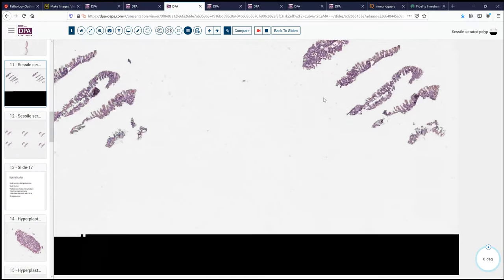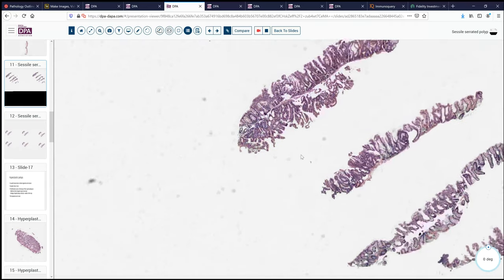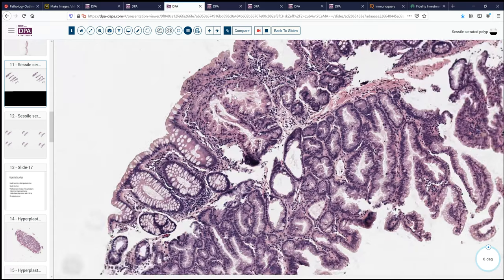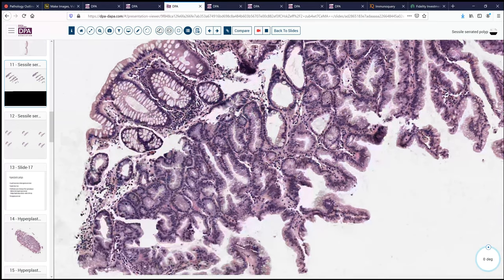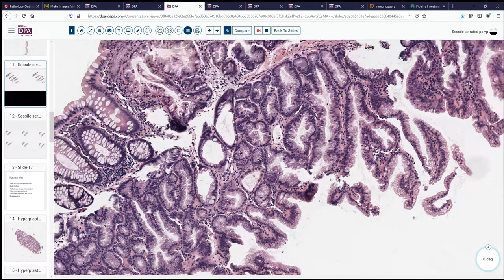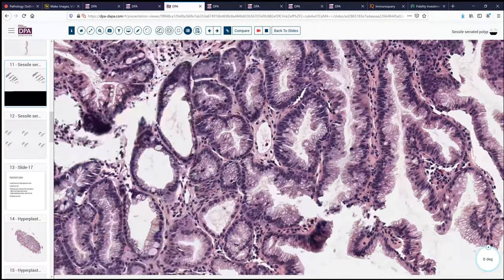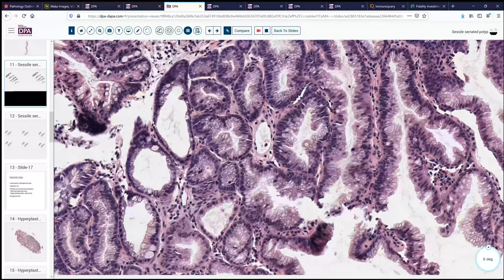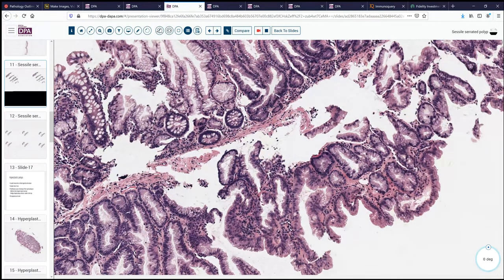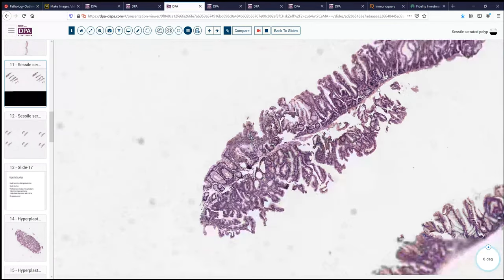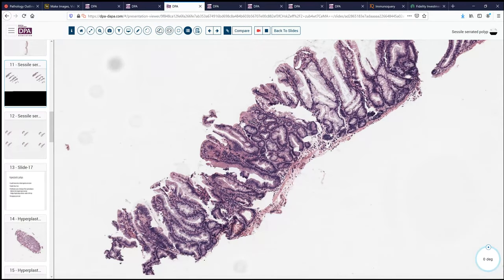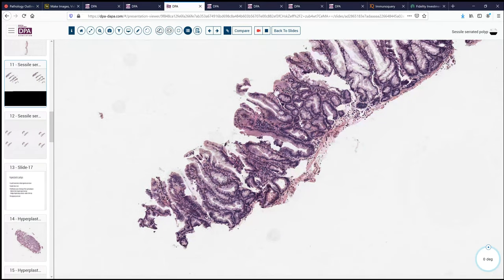Looking at another example here, we can see at intermediate magnification this undulating serrated type of surface. Looking at the opposite side, there is a little bit more complexity and these glands begin to become more confluent. Note that here is an area of hyperchromasia, which can be the beginnings of dysplastic changes in these serrated polyps. We see nice branching, boot-shaped glands at the base with dilatation. This would be an SSL sessile serrated lesion or adenoma, potentially with focally developing low-grade dysplasia.